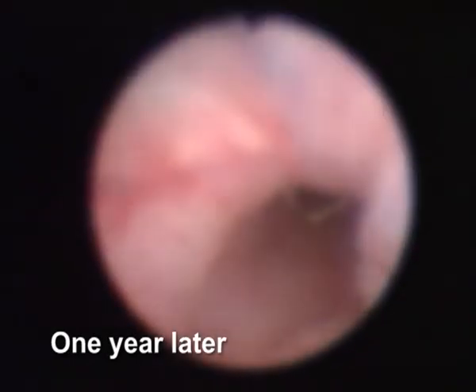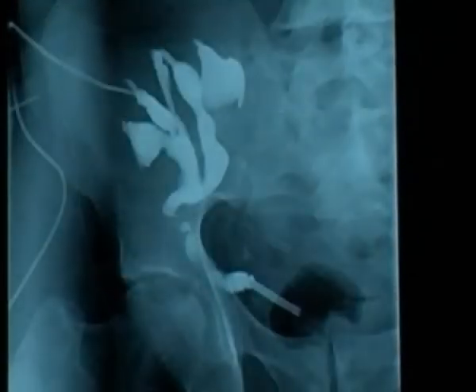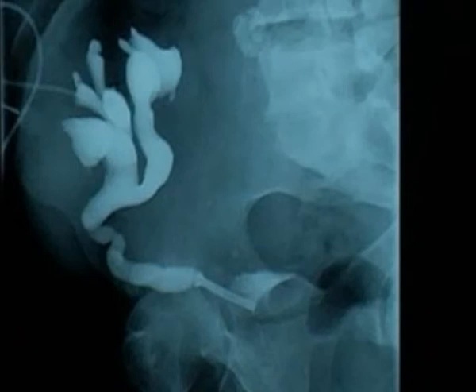After 1 year, the ureteric stent is in place and there are no signs of encrustation or tissue ingrowth. We have successfully used Memocats in transplant patients, which not only ensures long-term ureteric patency, but also avoids further complex invasive surgery.